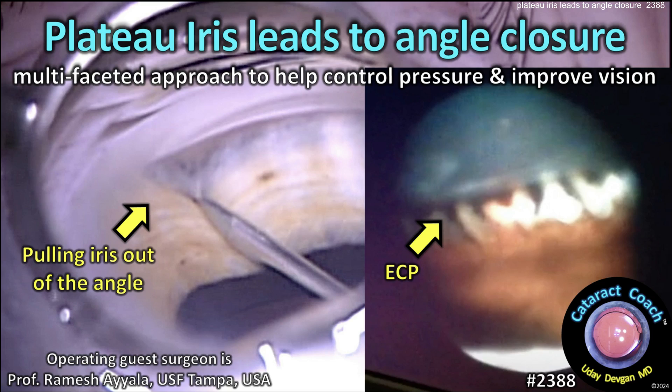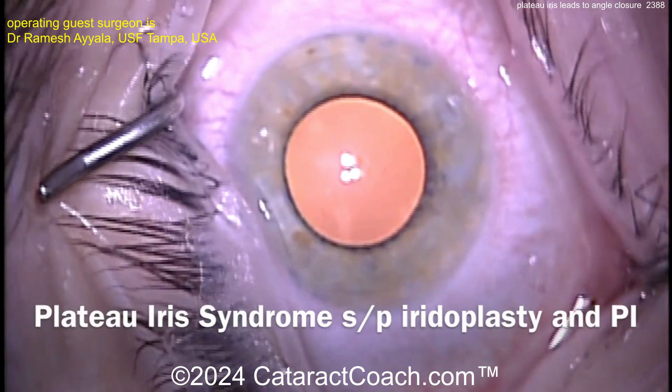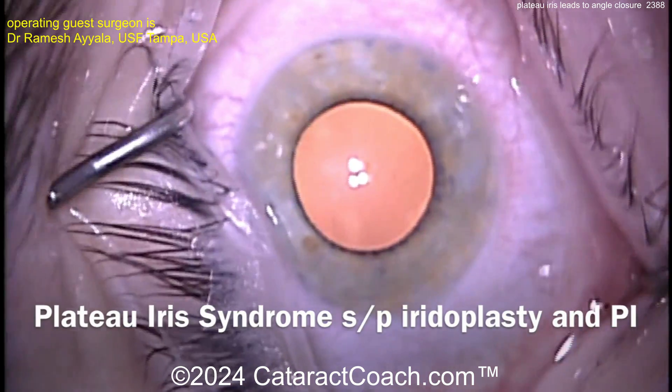Cataractcoach.com. Plateau iris leads to angle closure. Using a multifaceted approach to help control the IOP and improve the patient's vision. Here's a complicated case.